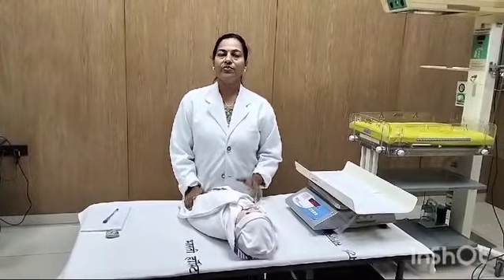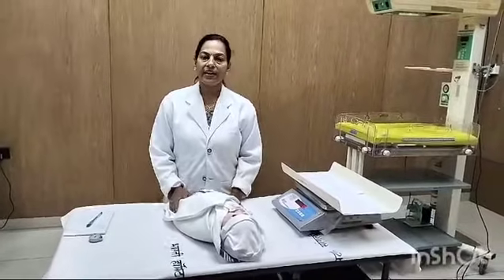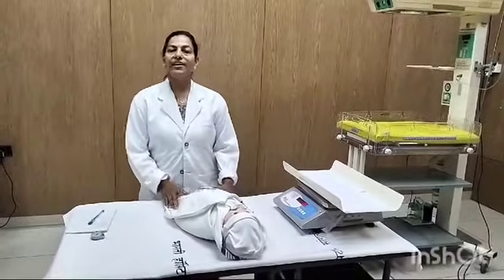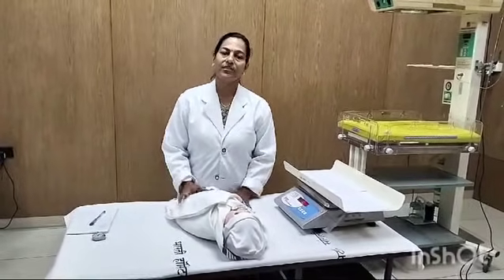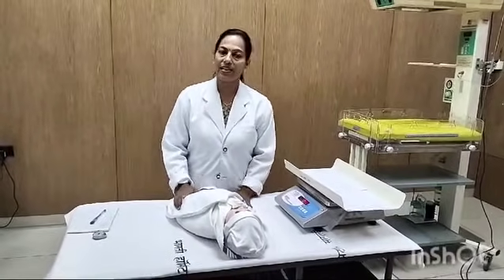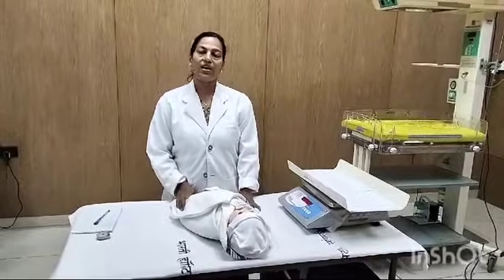Anthropometric measurement — here we need to check the baby's height, weight, head circumference, chest circumference, mid-arm circumference, mid-thigh circumference, and abdominal circumference.